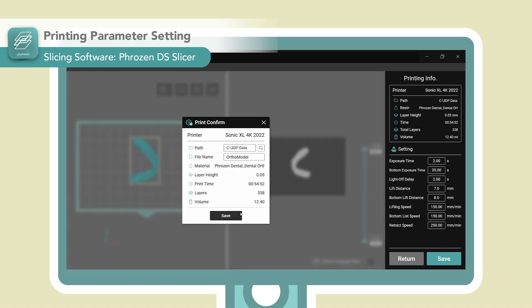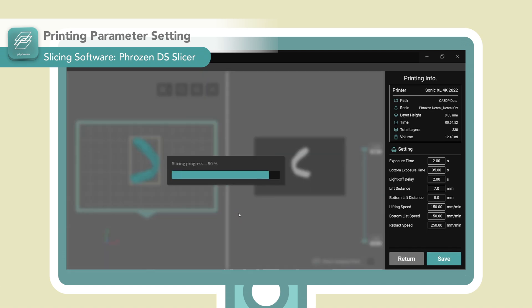As you can see, the DS Slicer did most of the work for us. Instead of spending hours trying to figure things out, we can have our model ready within just a few minutes.